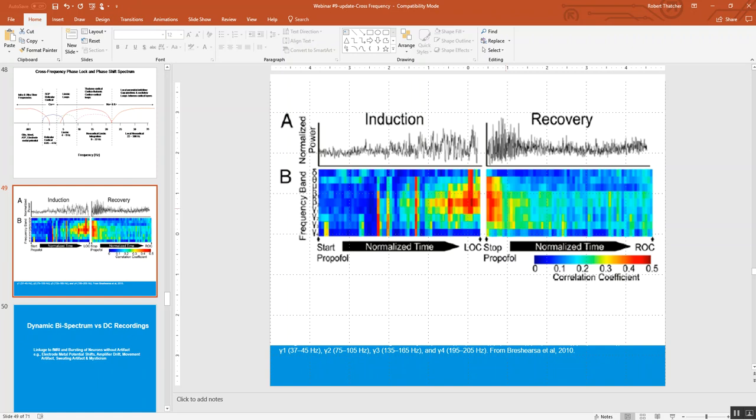There's differentiation and separation in the cross-frequency domain, and the greater the separation, the greater the clarity of thought and functioning. You can see that after this period of time, you still have not recovered the pre-induction status of the brain, and so it takes time for the brain to recover and to decouple and differentiate cross-frequency wise.